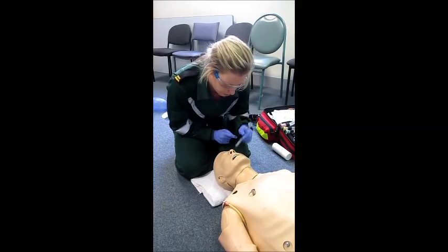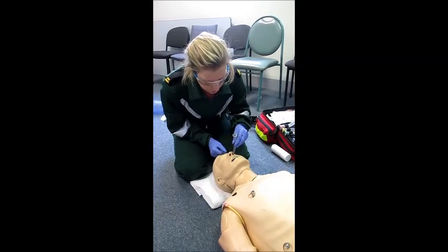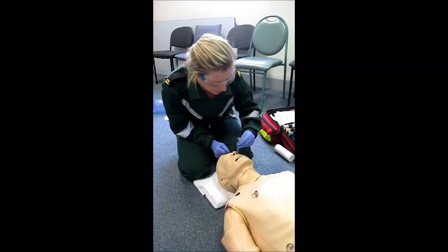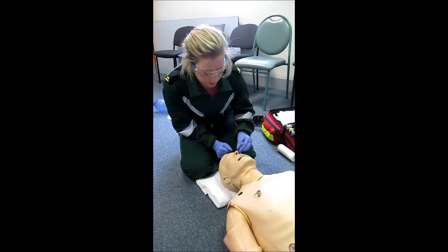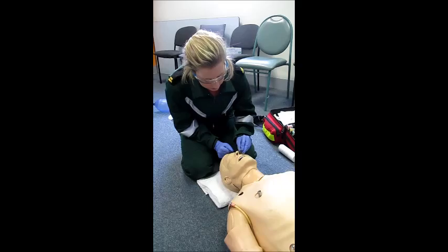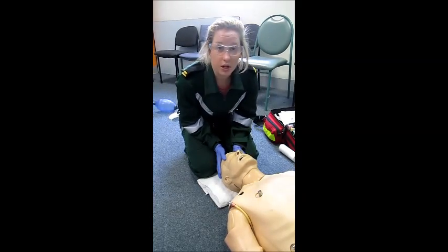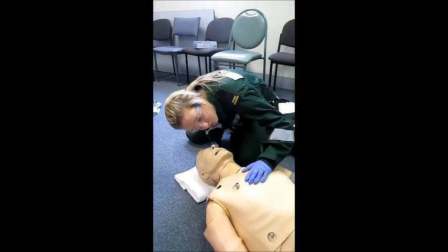I'm going to put the NPA in at a 90-degree angle and gently guide it down, rotating it clockwise and anticlockwise to help. If there's any resistance, I'm going to stop and not force it down. This one is going all the way down, which is good. I'm going to check if there's a gag reflex and also look, listen, and feel for any air movement.